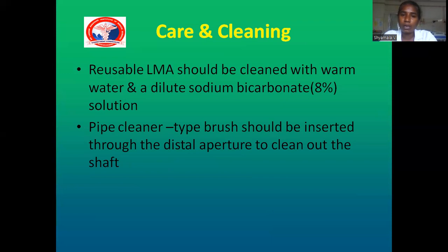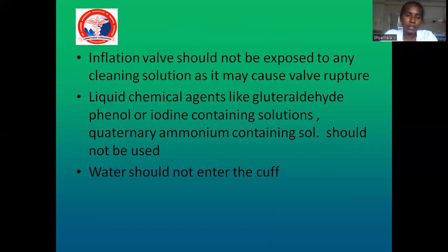Normally the LMA has to be cleaned with warm water and dilute sodium bicarbonate 8%. The inflating valve should not be exposed to any of the cleaning solution, because the inflating pilot balloon, if you are using any solution to clean, sometimes accidentally some material will go and lodge into the cuff. It will cause rupture of the valve. Liquid chemicals like glutaraldehyde, phenol, iodine containing solution, and quaternary ammonium solution should not be used.